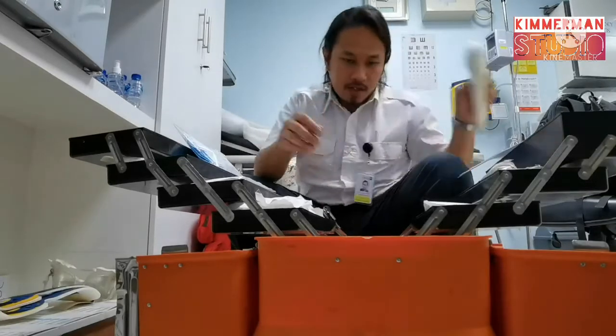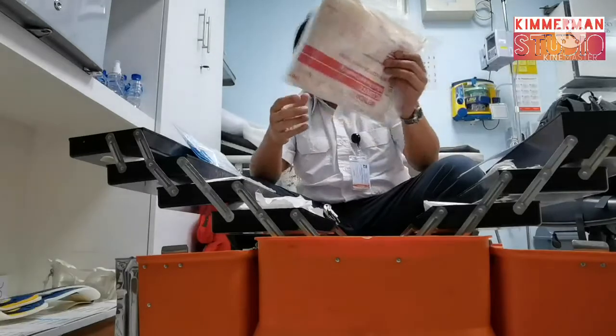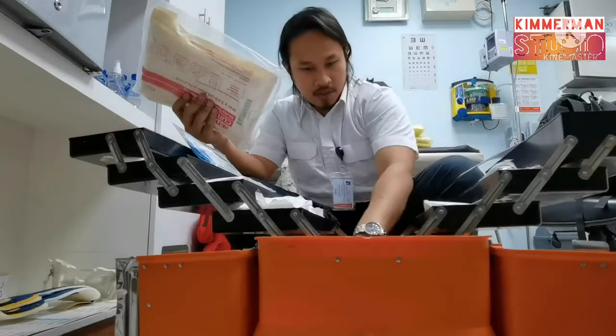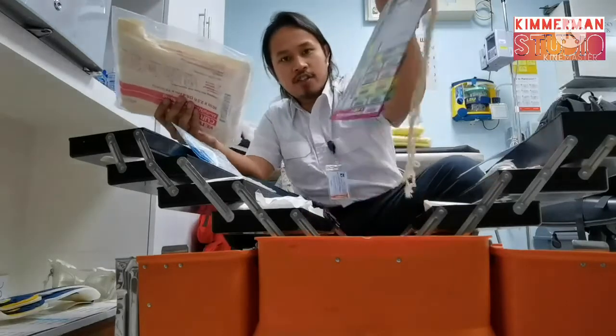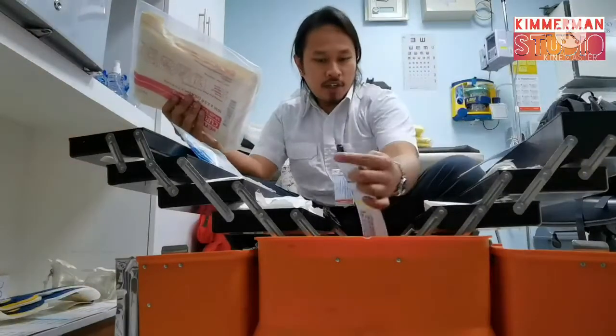Infusion pump. Multi-trauma dressings. Another multi-trauma dressing. Also, we have here triage tags. I have a video for this also on how to use the triage tags.